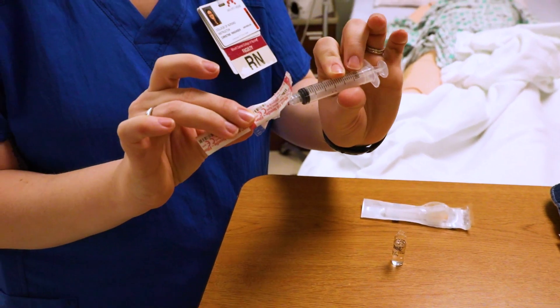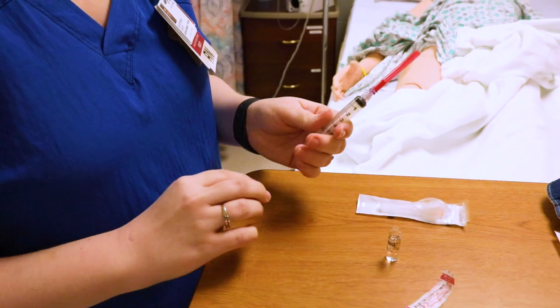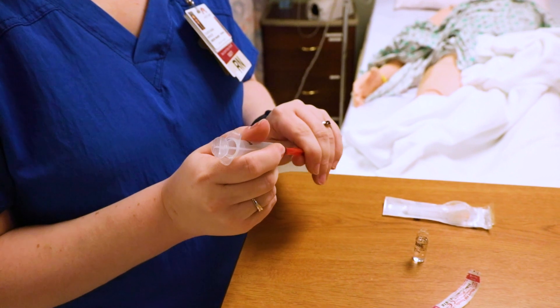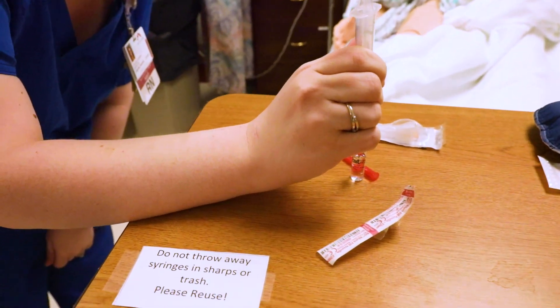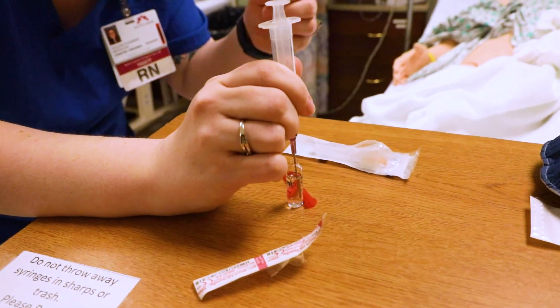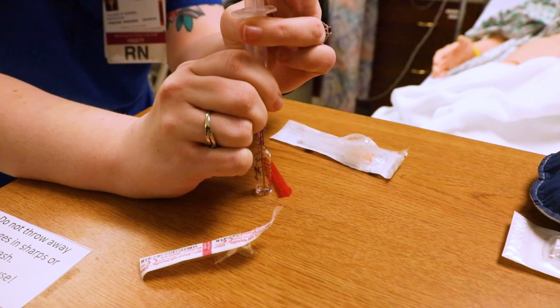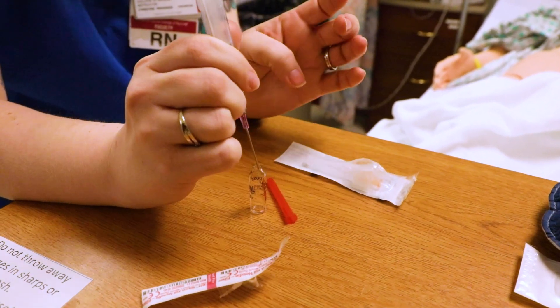Take your syringe and make sure you open it very carefully so you can put the two pieces together. When you take this off, remember you don't want to poke your fingers, so put the filter needle in just like so, and draw up however much medication your doctor has ordered.